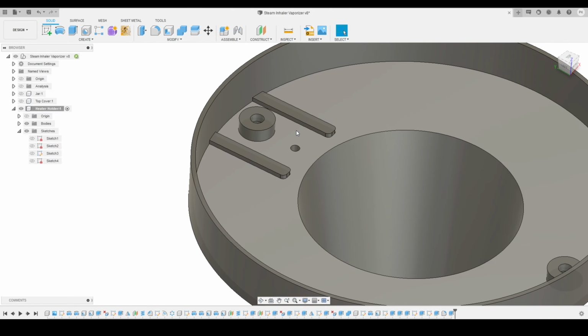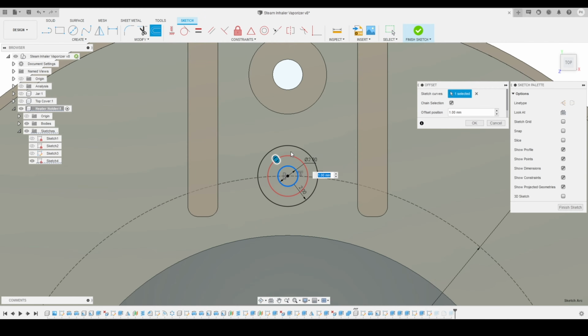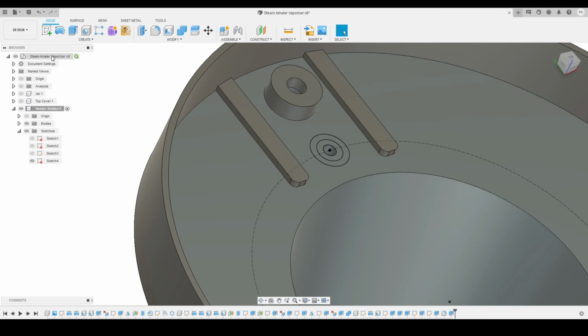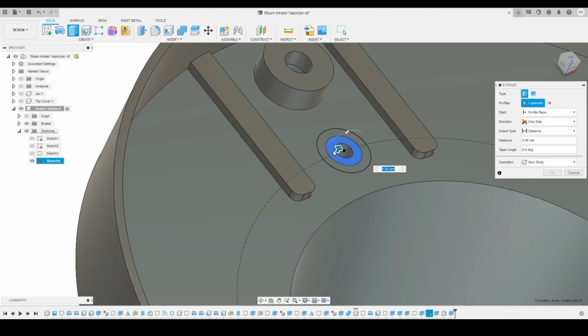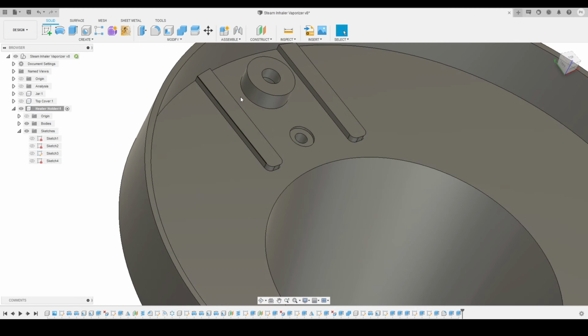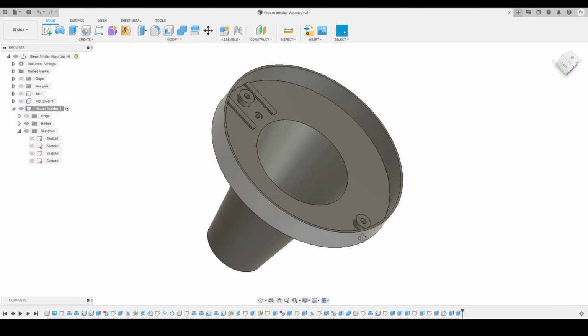So I will go on to the sketch and double click to edit the sketch. Here I will add one more circle by offsetting this circle by 1 millimeter. Here you can see, and I will click on finish sketch. And now again I will turn on my sketch. So here you can see this is the profile. I will select this profile now by activating the extrude tool and give it a -0.4 millimeter distance. So here you can see I'm always giving a recess for the screws.